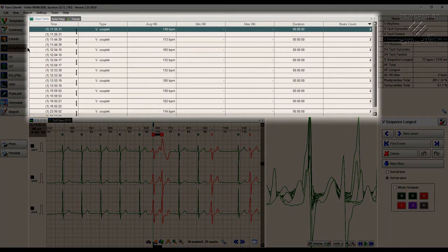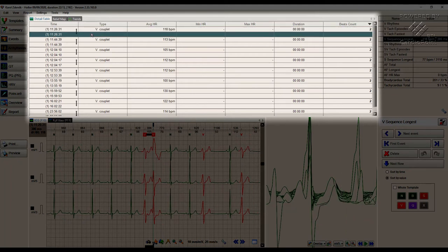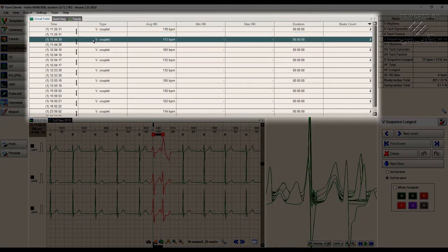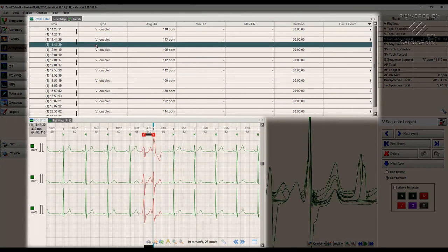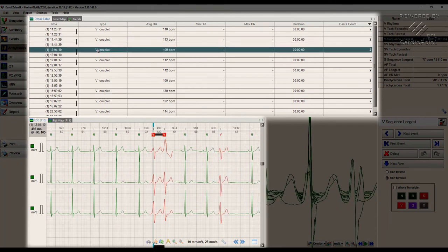For each event, we can inspect its beginning and ending time, duration, average heart rate and the number of beats within the episode. Any episode can also be carefully considered on the corresponding ECG view and any adjustments can be made if needed.